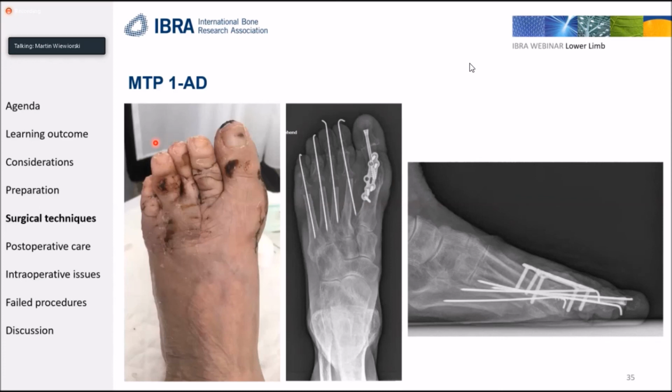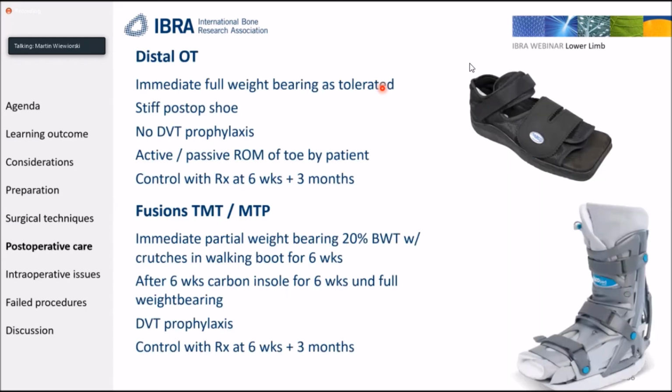This is actually the clinical view after 6 weeks, and I think this looks like a foot again if you compare it to the preoperative situation. Luckily, I didn't run into any soft tissue complications in this procedure. So maybe to go quickly over the postoperative rehabilitation.